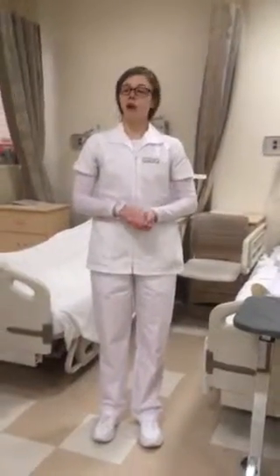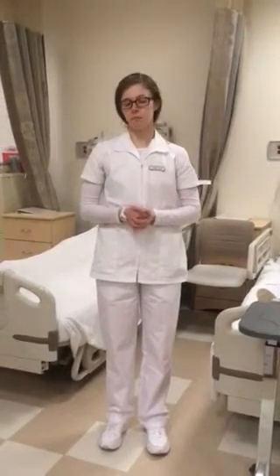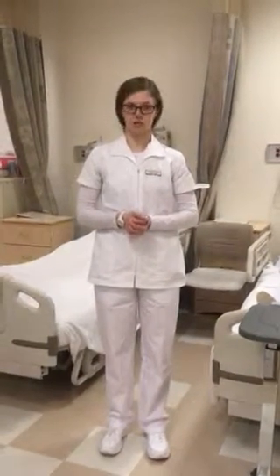Number 4 would be to identify the patient. Number 5 would be to introduce myself. Number 6 would be to explain the procedure. And number 7 would be providing privacy for them.